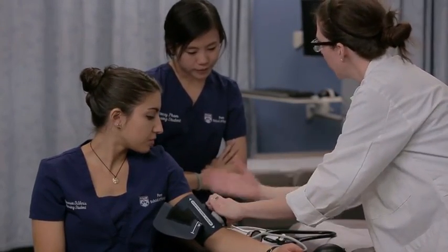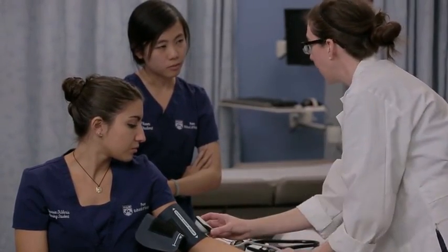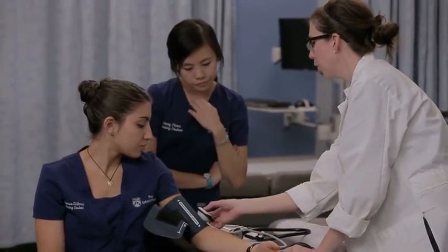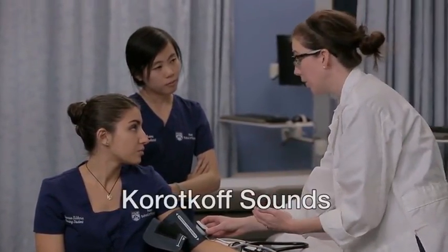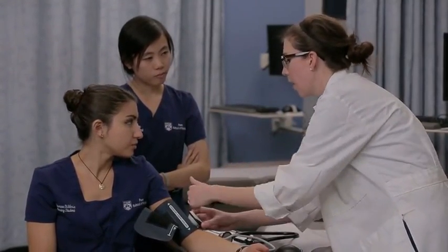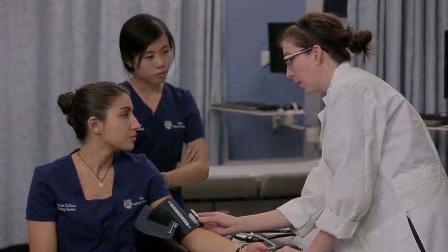Once I've reached that point and can't hear anything, the arteries are fully occluded. I'm going to release the gauge and deflate the cuff, listening and watching the gauge. When I first hear the blood rush back into her brachial artery, I'm going to make a note of the reading. The sounds that we hear are called Korotkov sounds. The first Korotkov sound is the first sound we hear — the blood rushing back into your artery. After I hear that first Korotkov sound, I'm going to continue listening and watching the gauge, and when I no longer hear the turbulent sound, I'm going to make a note of the reading.